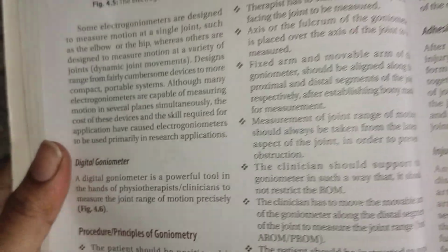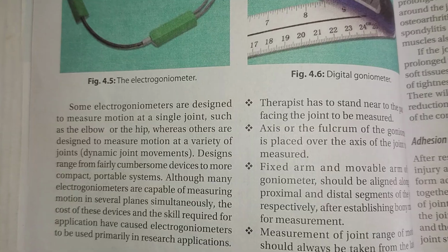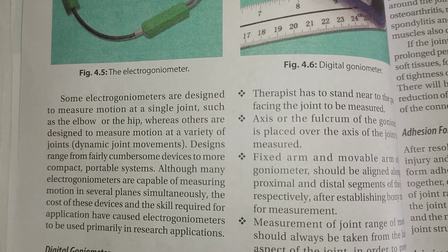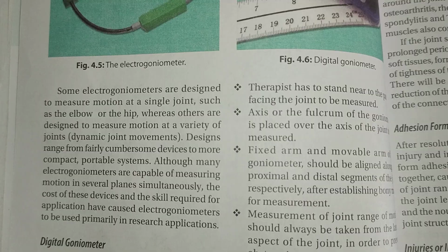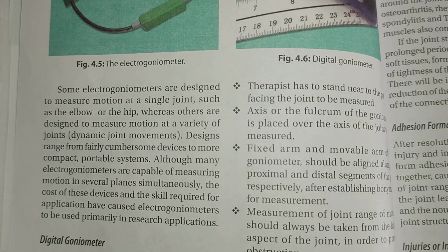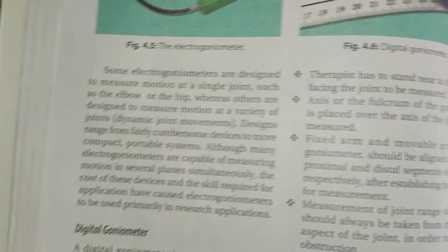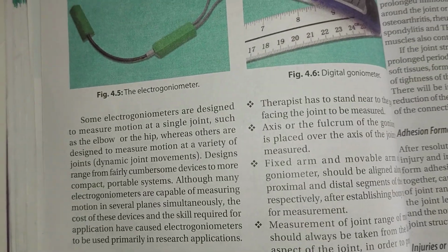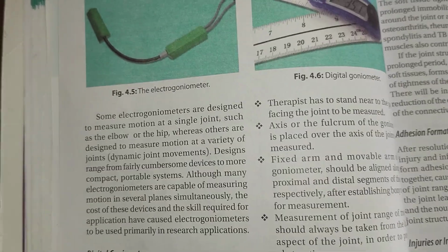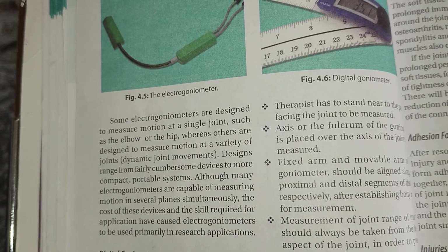Then we measure the joint. Some electrogoniometers are designed to measure a single joint, such as the elbow or hip, whereas others are designed for dynamic movements. It is mostly used for the hip and elbow. Designs range from fairly cumbersome devices to compact portable systems.